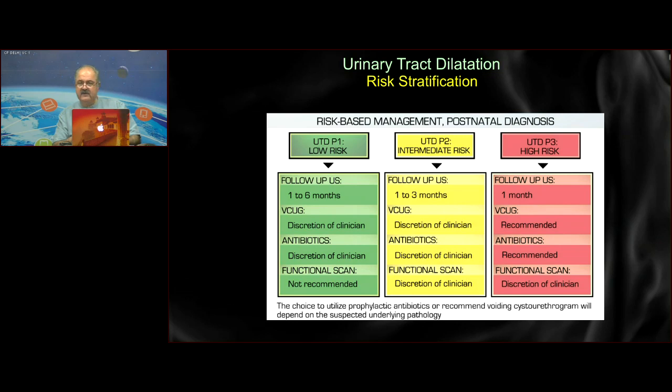Bilateral renomegaly with increased echoes, we've discussed this extensively. The larger the kidney, the greater the chance of autosomal recessive, and with the rest of the group, we normally find normal sized kidneys. How to assess the renal parenchyma thickness in the kidney?